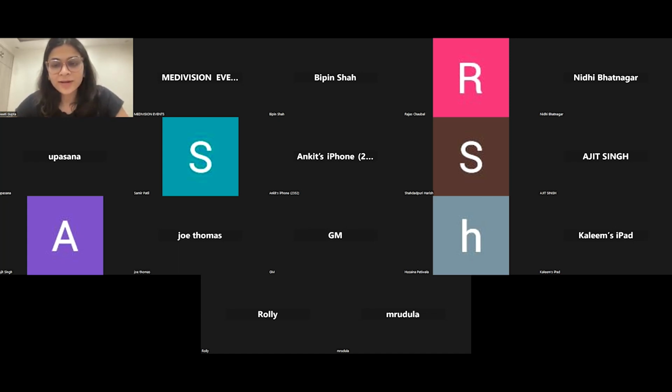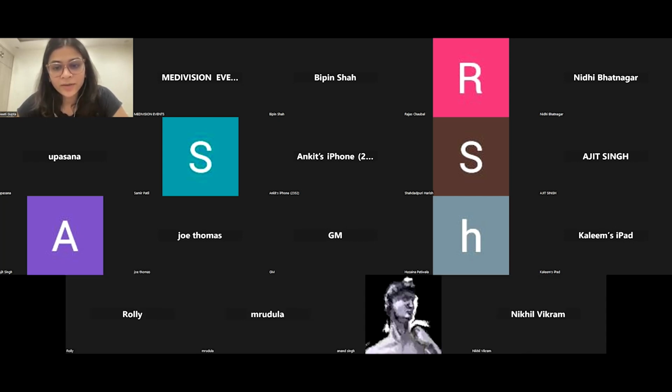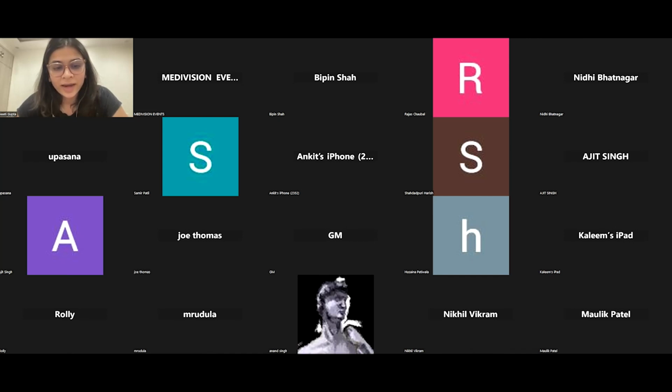Yes, thank you, sir. Good evening to everyone, my respected seniors and colleagues. I hope I'm audible. So I'll just share my screen. To introduce myself, I am presently a consultant radiologist working in Sant Parmanand Hospital, Delhi. And I report everything, general radiology, but after UCAM, I've been getting a decent share of musculoskeletal ultrasound cases, and I'd like to share one of the interesting cases that I came across.